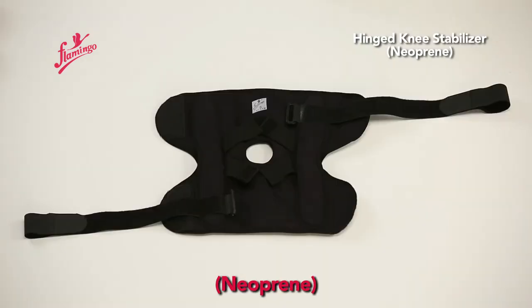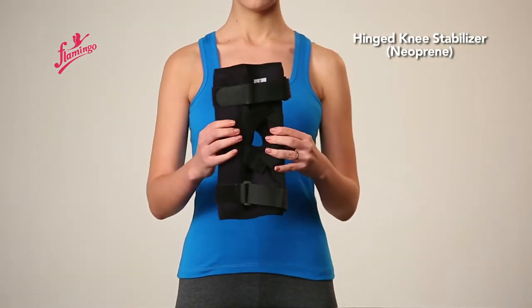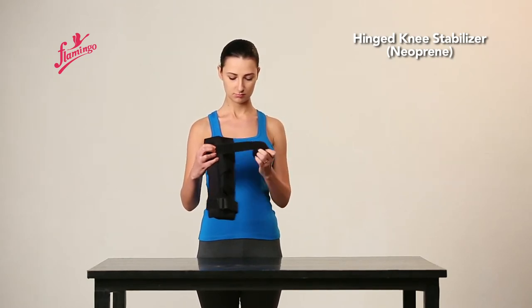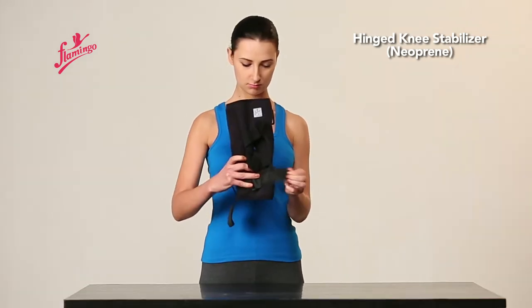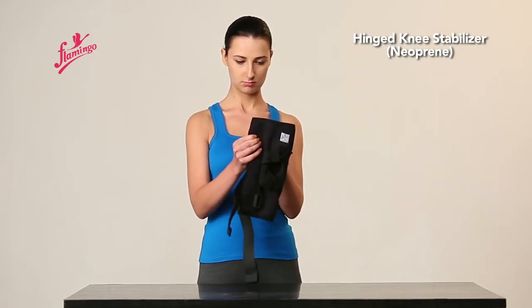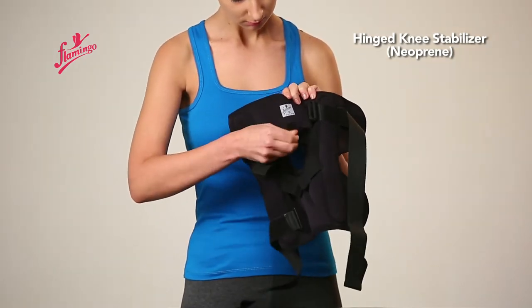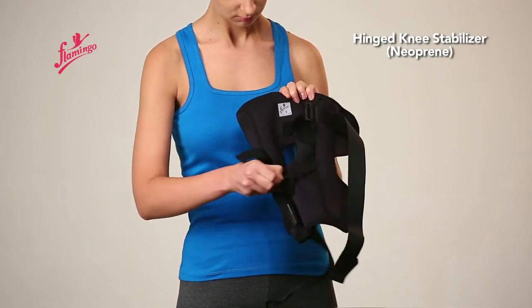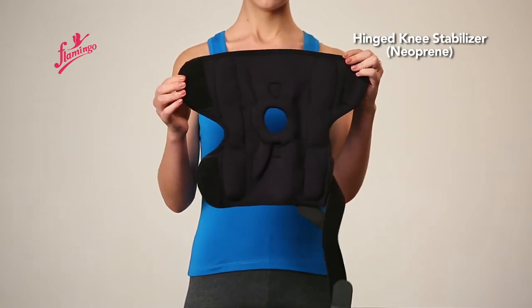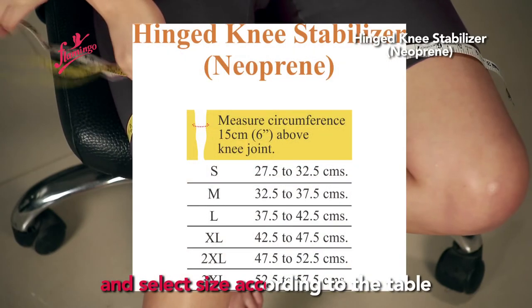Hinge Knee Stabilizer. Measure circumference 6 inches above the knee joint and select the appropriate size according to the sizing table.